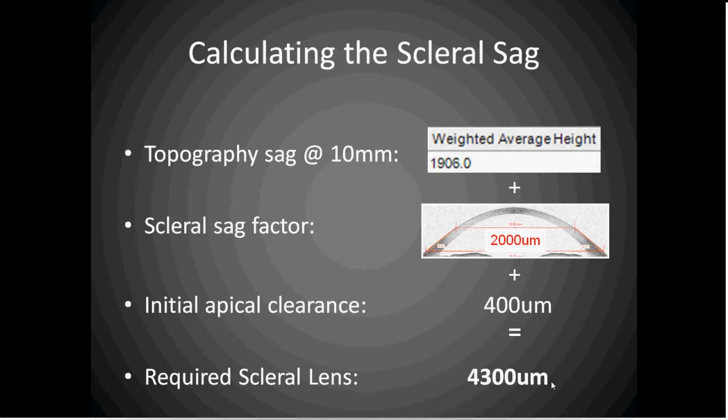However, if your scleral lens does not land at a 15 millimeter chord, then use the corneal sagittal depth from your Medmont topographer, knowing that 1750 microns is the normal depth of cornea. If you have a measurement of 2000 microns, then you know you should go up higher in sagittal depth in your trial lens set.